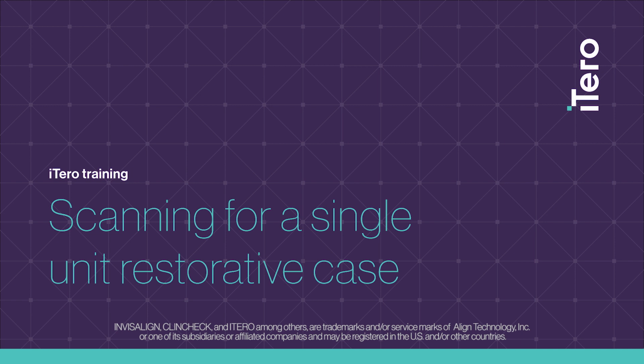Scanning for a single unit restorative case is easy with the iTero Element Scanner. In this example, I will demonstrate how to include the pretreatment scan of the patient's existing anatomy that I would like the lab to replicate.